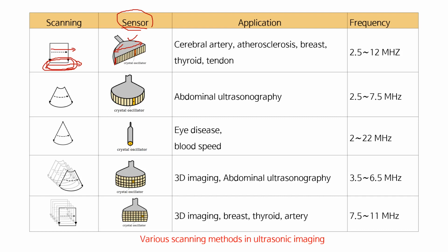And with this shape of transducer, the crystal oscillators arranged in a circular type, we can actually detect a wide range at the same time.